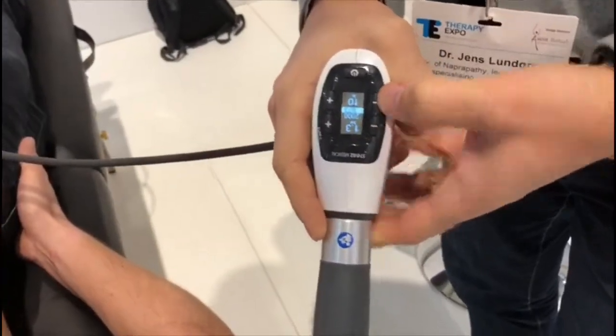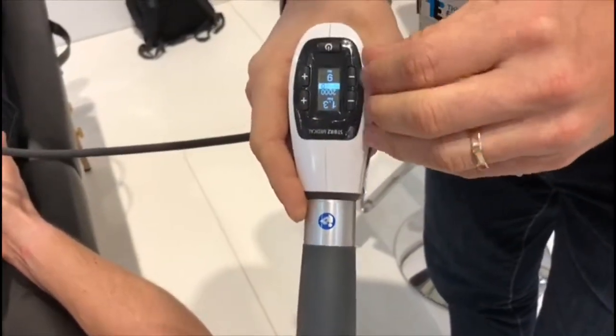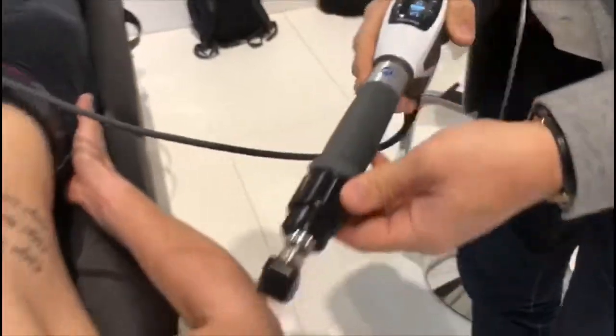Lower the energy to 1.3. I reset the counting system, like that. That's a good setting.